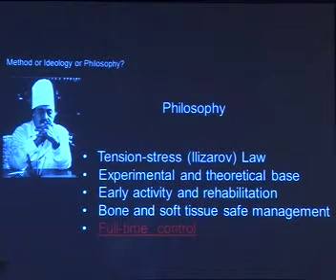So for me, Ilizarov is a philosophy, because it is based on basic great principles. First of all, it's the Ilizarov law, or tension-stress law. It's very important. It is based on an experimental and theoretical base. And of course, early activity and rehabilitation is very important too. Another very important thing is that bone and soft tissue management can be done very well using the Ilizarov method. But the main principle is, of course, full-time control.